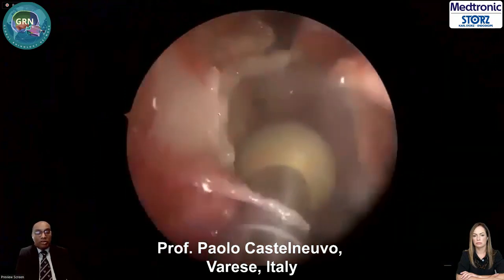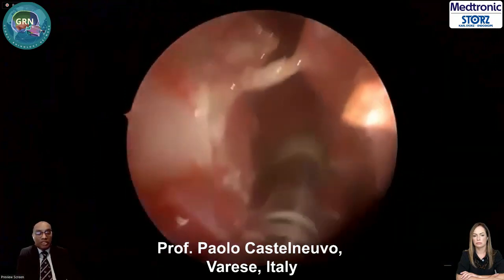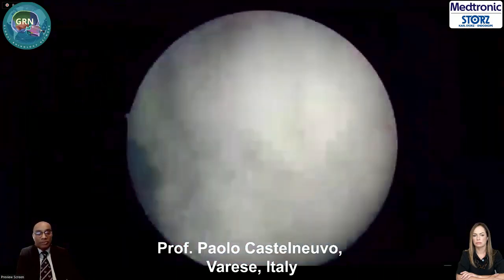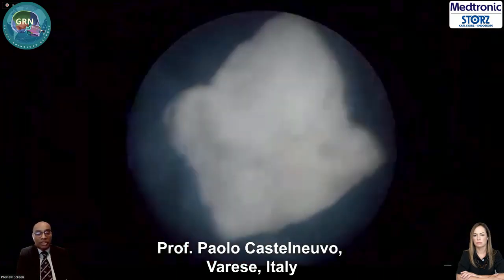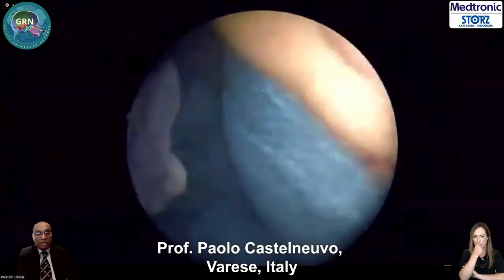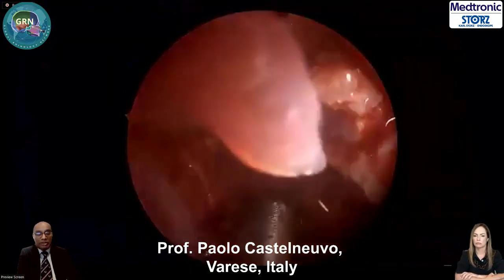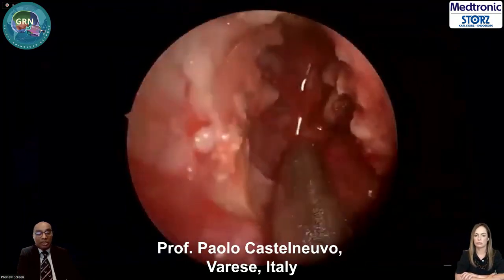So, Prof, as we develop this further, we'll just quickly visit Dr. Jankiram, who is drilling out the pterygoid wedge. So we'll visit them and be back with you while clearing the tumor. Thank you. So over to Trichy, please.